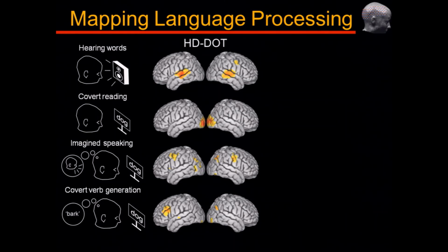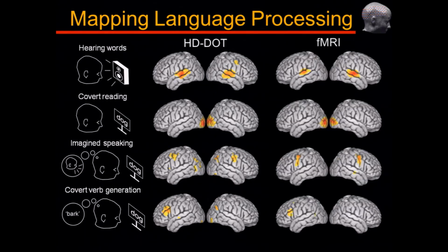So these are the images that we have averaged over 8 subjects. We take the same 8 subjects and scan them with MR, and we get these maps. So this allows us, as in the mice, where we would be co-registering fluorescence markers against histology, or fluorescence markers against PET, here to judge oxyhemoglobin maps with optical against fMRI maps with BOLD.